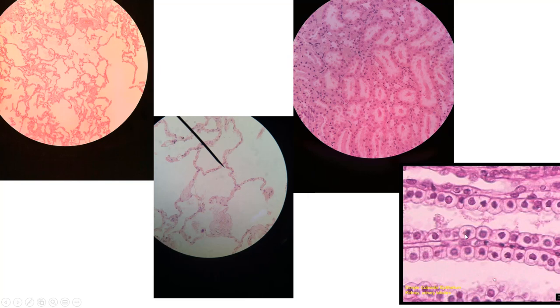We come over here, this is simple cuboidal found in the kidney. So you can see zoomed out a little bit, you see that this cuboidal tissue is making up what we call the kidney tubules. And so you get some cross sections like this, you see some longitudinal. This is another version of simple cuboidal that's a longitudinal section.